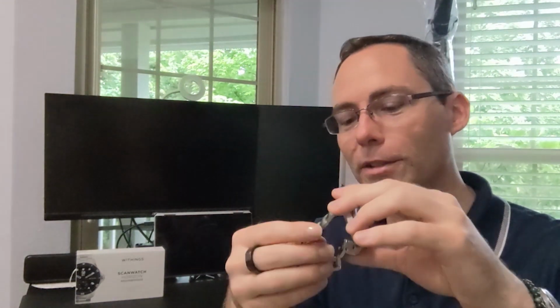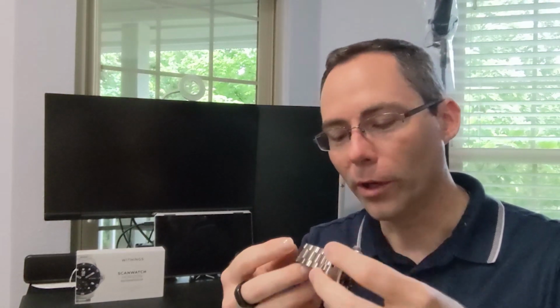Otherwise, stylistically, I really like it. It's very nice. It did take me probably 3 or 4 tries of making little adjustments in the links, taking out one link, putting in, there's kind of one small link here that's smaller than all the rest of them. Just kind of moving links around to try and get it to where it was comfortable for me to wear. But once you have it set, you don't have to worry about that. So you may take 3 or 4 tries, as I did, to get it to a place where it's really comfortable to wear. But once it's good, it's good.